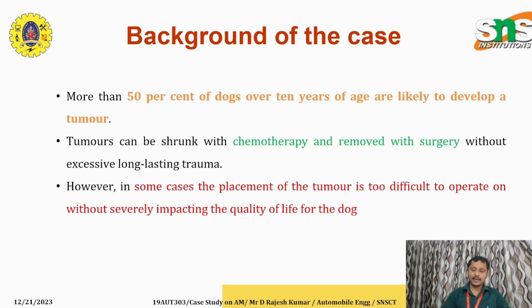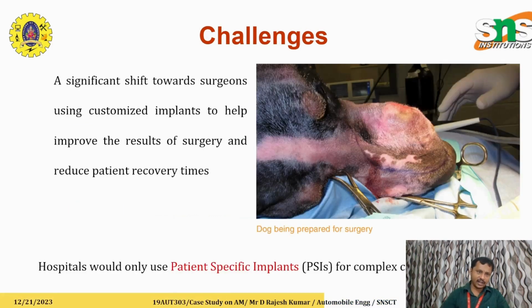So here they went for a surgery. Before going into the surgery, the measurement of the dog's nose should be modeled through a CAD model. The challenge here is a significant shift towards surgeons using customized implants to help improve the results of surgery and reduce patient recovery time.